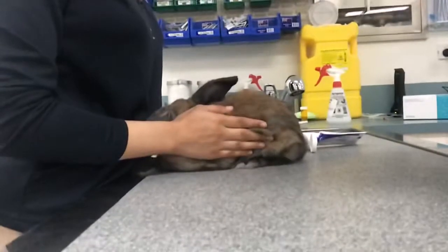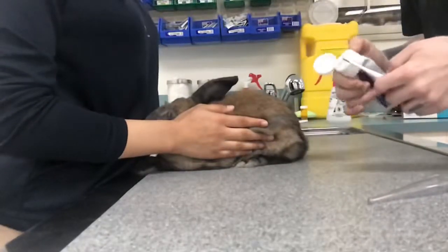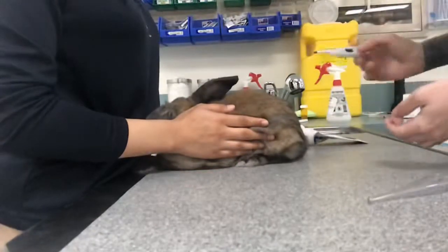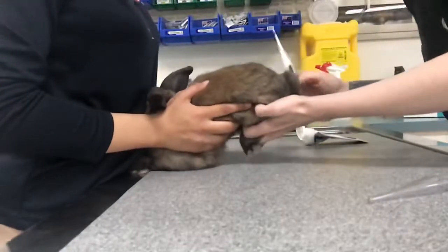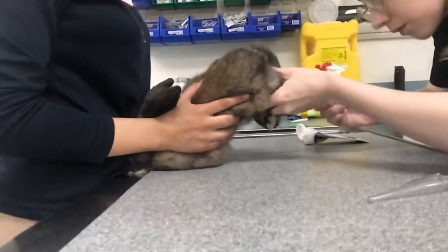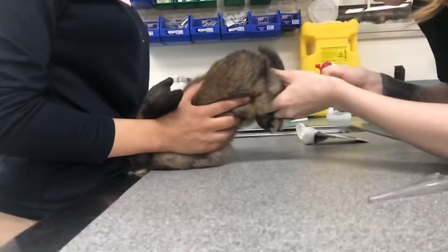Ready. So this is a rectal temperature on Flopsy. Just going to turn that guy on and make sure you get a reading. Add some lubricant to the end of the thermometer so it's not super uncomfortable. And then, very gently, there we go. Refresh. There we go. Wait for it to get a reading.